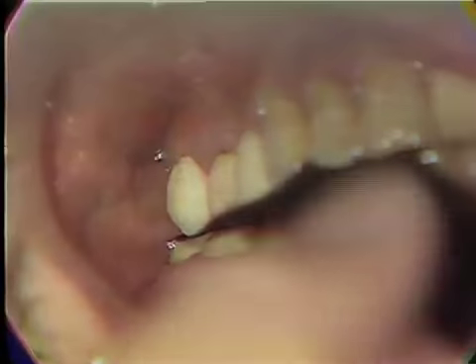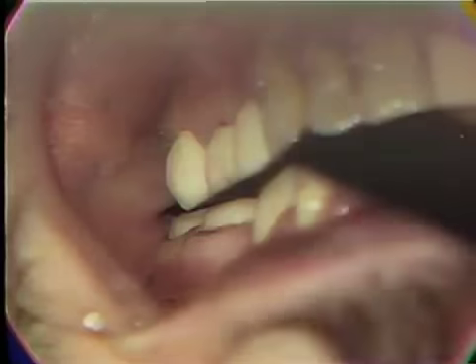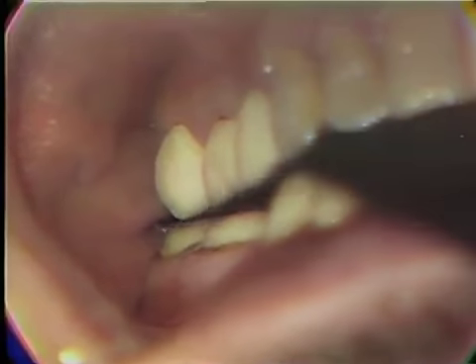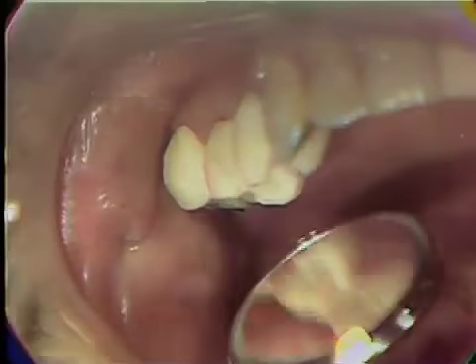Close, please. Open, close, tap, tap. Make sure the occlusion is good in centric, and also, open, please, close, is good in working, balancing, and protrusive. Move from side to side, please. And out on your front teeth, and back, open. So the occlusion on the temporary should be as fine as you can get it.